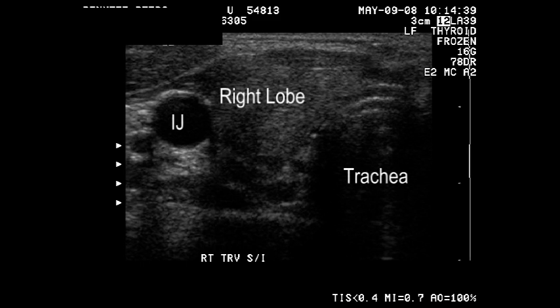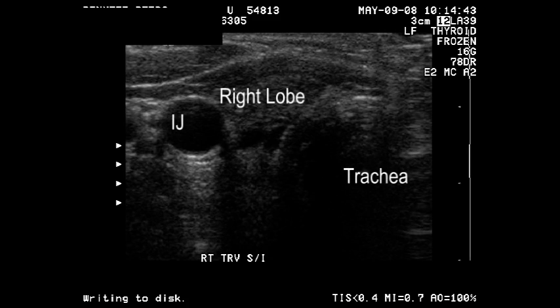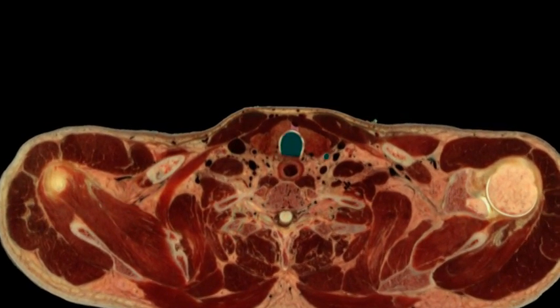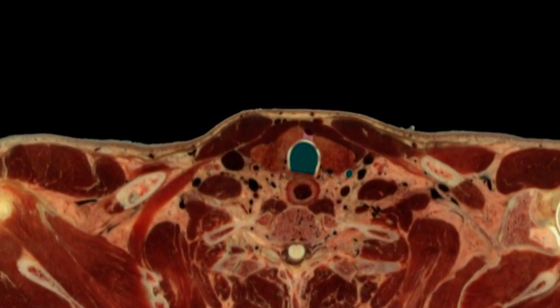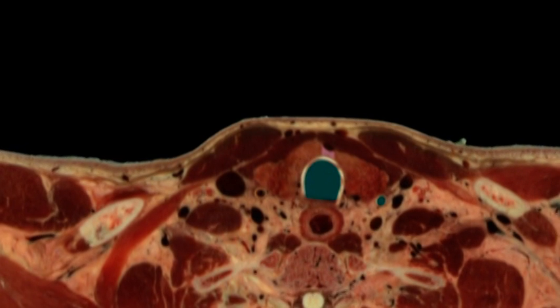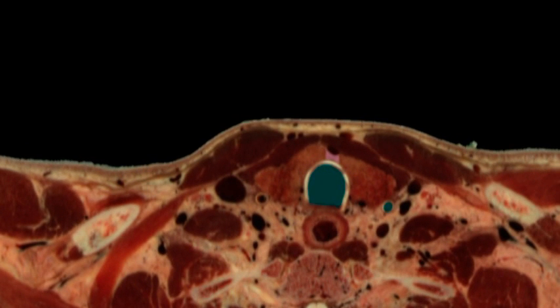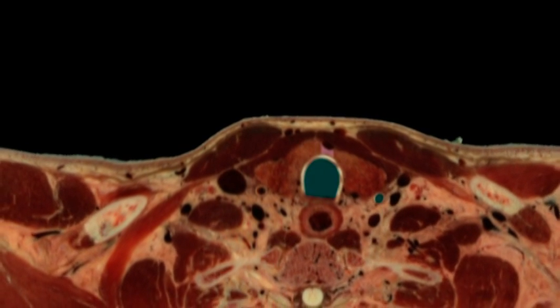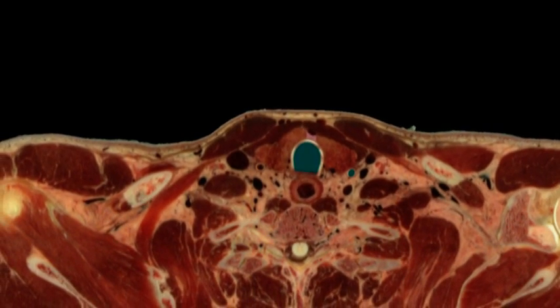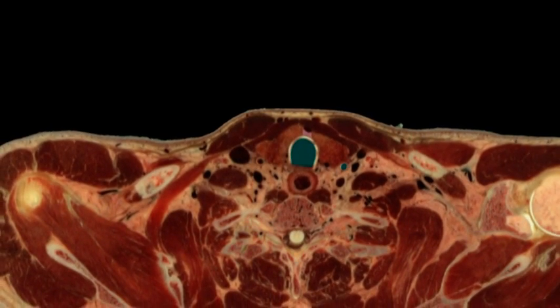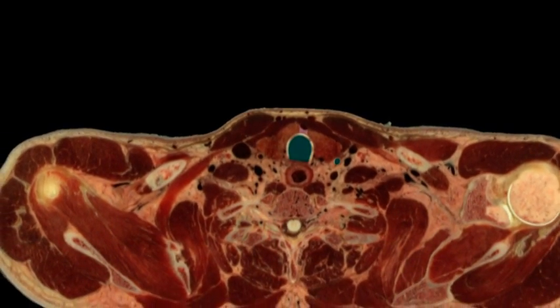Again, orient yourself. The internal jugular vein, the trachea, and the right lobe are clearly seen here. Bringing these views again to VH Dissector, we once again orient ourselves and notice that the internal jugular vein lies much more lateral than the carotid artery, which lies more posterior in these images.